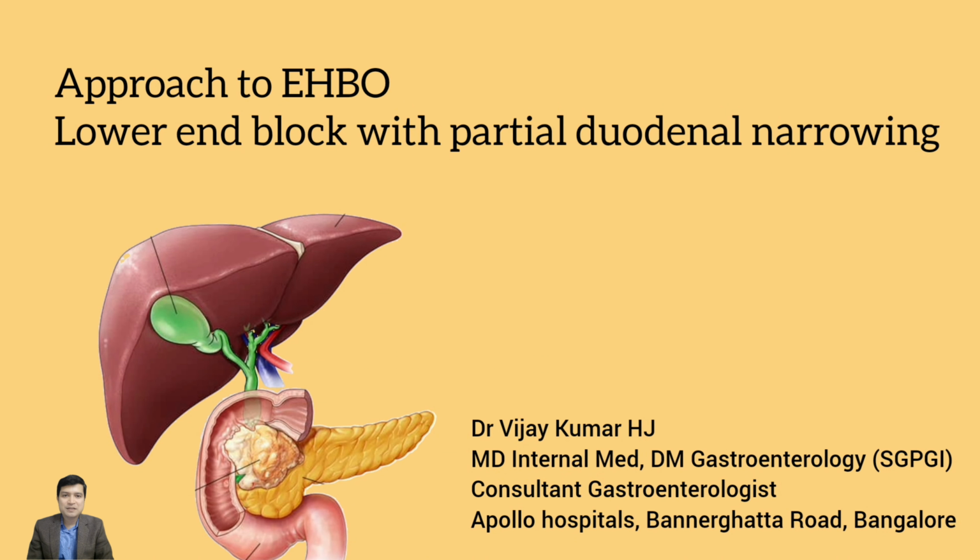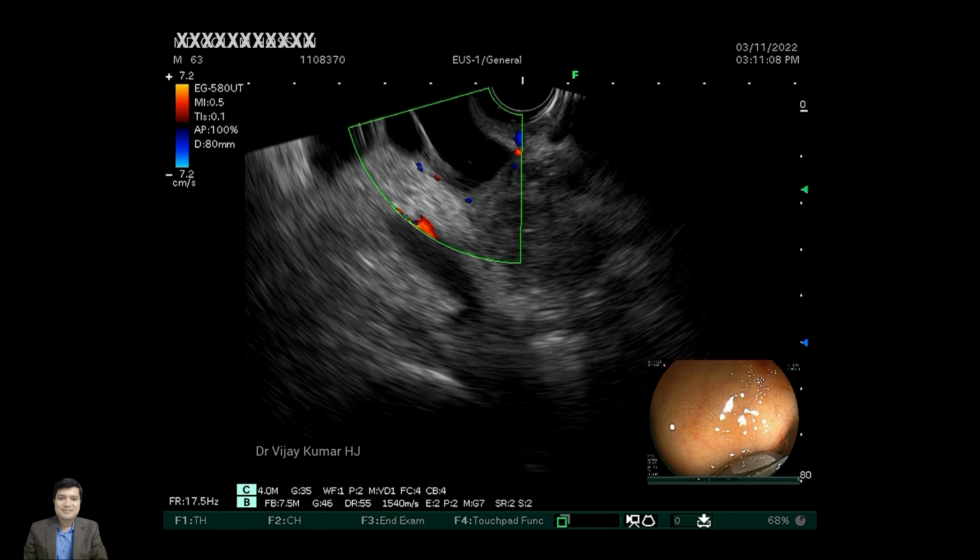This procedure was done for an elderly gentleman who had unresectable carcinoma head of pancreas, and the normal method of ERCP, that is through the papillary method, was not possible for this gentleman because of altered anatomy. So we did EUS-guided choledochoduodenostomy for him to establish a biliary drainage.